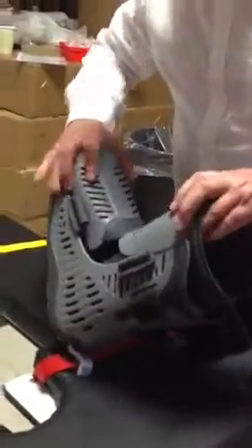The pneumatic pump on the front here, what that does is it fills in down the 2 sides of the calf, and what that does is it makes it very efficient, because what we're doing with the boot mostly is rotating the leg. So by closing the gap around the calf, we take away any sort of freedom of play inside, so we get very efficient rotational thing.